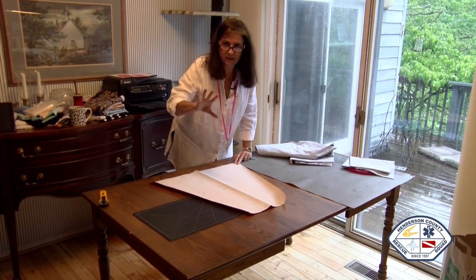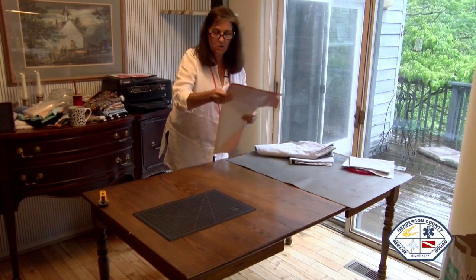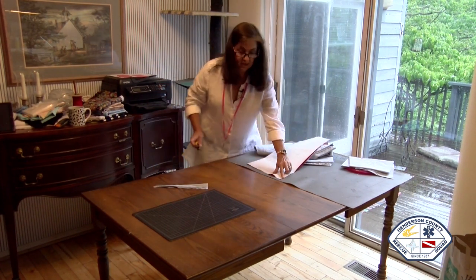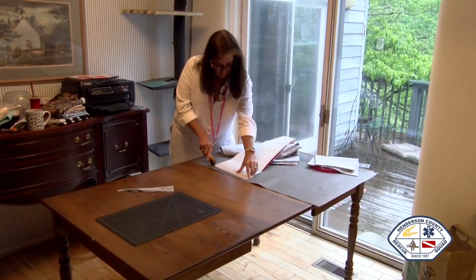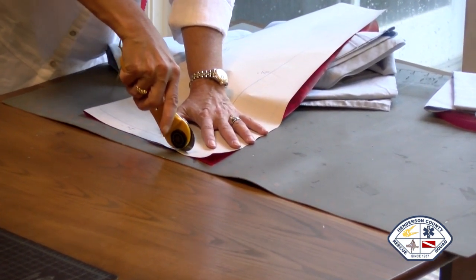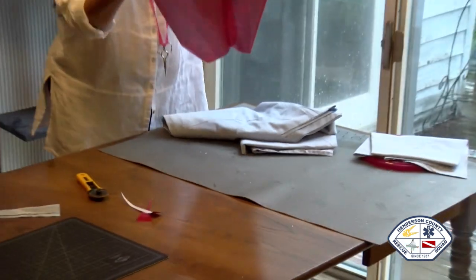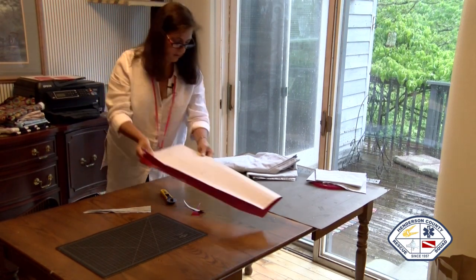Now, a shoulder when it goes in has to have a little itty bitty bit of a curve. We cut out that 1-inch notch. So we're going to cut an inch down on this corner. And this we're just going to eyeball. I have it marked with a little bit of a line. We're going to give it just a little bit of a curve. There you go. Now on both sides of your pattern, you've got a bit of a curve. Not a lot, just a little.